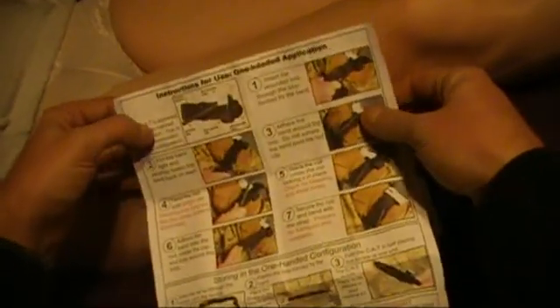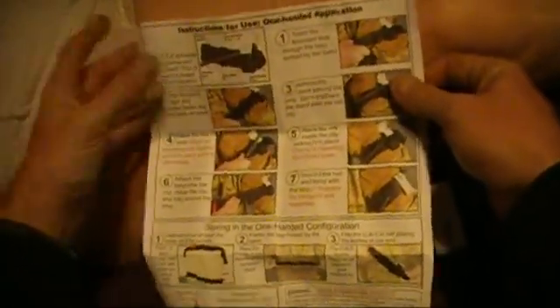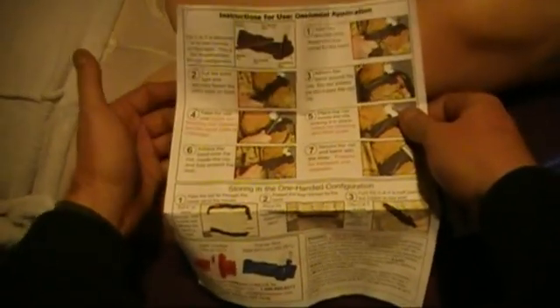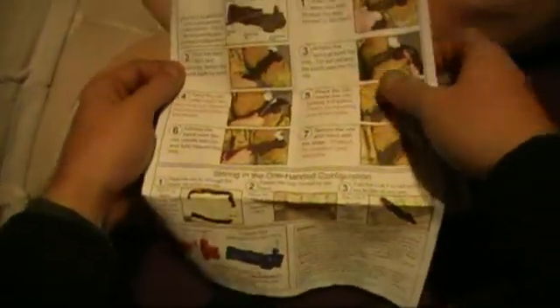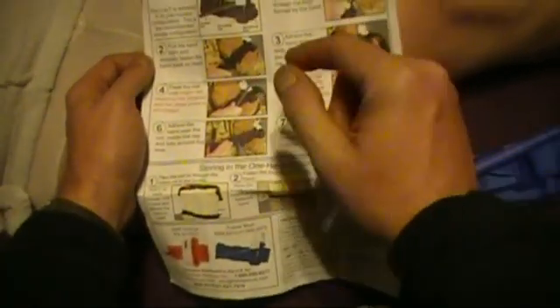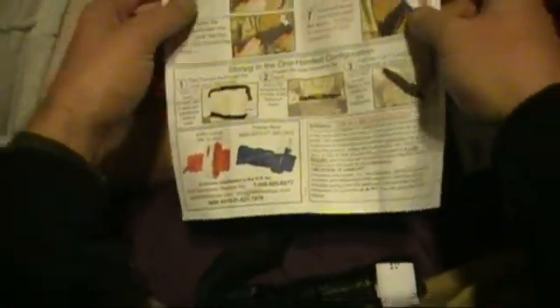When you get them, the neat thing is they come with instructions, and most people have a tendency to throw these away and assume that they know how a tourniquet works. The things written in red in the instructions are actually the important stuff that you need to know, and we'll cover this in detail. Before you even use one of these, you should really play with it and see how it works. It's actually a very simple process.